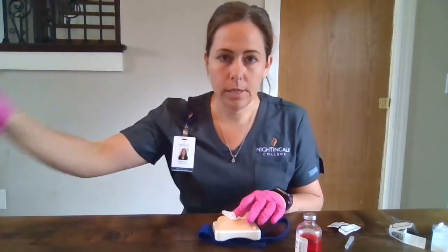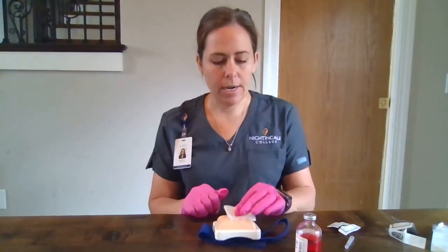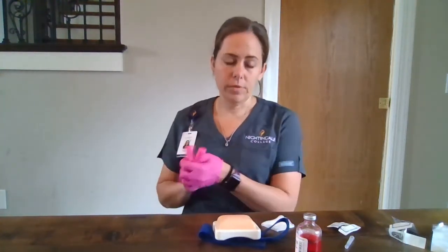If our needle has a safety mechanism, we will initiate that safety mechanism, put our needles in the sharp container, bandage this if necessary. We will discard our supplies, remove our gloves, and perform our hand hygiene, and then document our procedure.